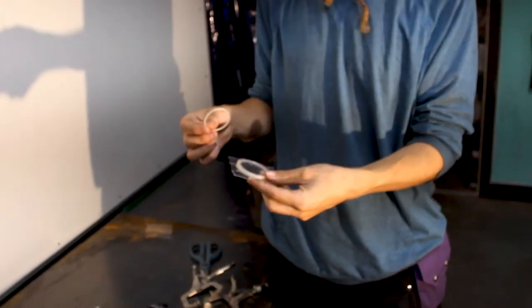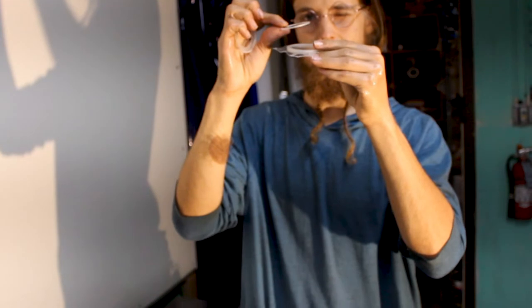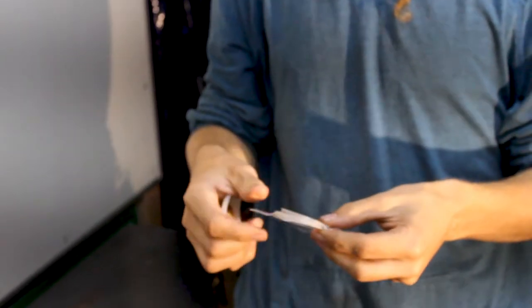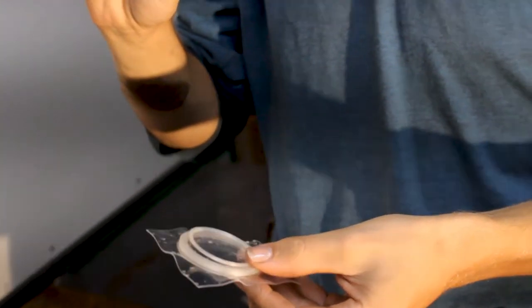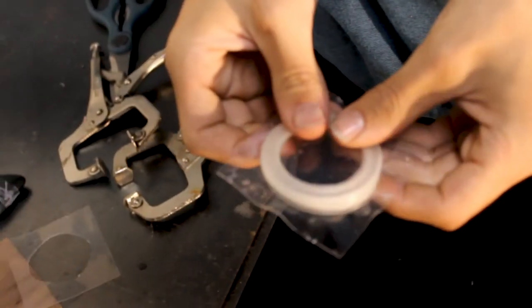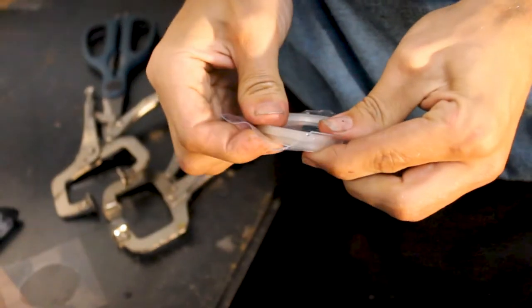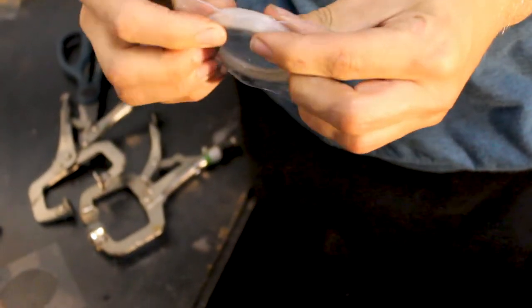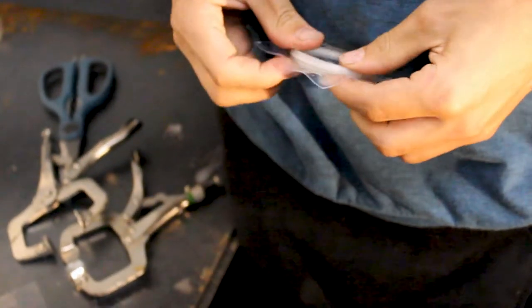So we just filled this with fluid. I'm gonna put the ring in with the lip on the outside. That's just to make it fit in there. And then this is the, what do I call this? The wedge, because at one revision it was wedge shaped. But yeah, I'm gonna do the same thing. Just get it in and kind of go around the edges and see if I can squish it on there. I might have to sand this down if it doesn't want to get on. Oh yeah, no, it's going.